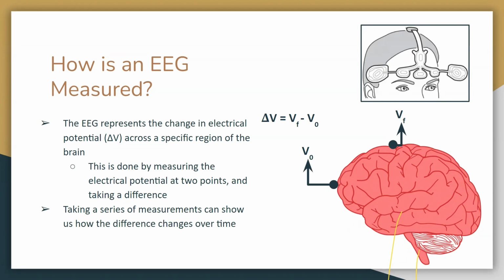There are five measurement points being put on the patient's head. There's a central point, which is your reference, and then all four are different subtracted values. So I have 2 for the left hemisphere and 2 for the right hemisphere of the brain. And I'm using those to construct the information: the upper spectrogram is meant to show the left hemisphere and the lower one is meant to show the right hemisphere data. But that's what is actually being done when you attach the electrodes.